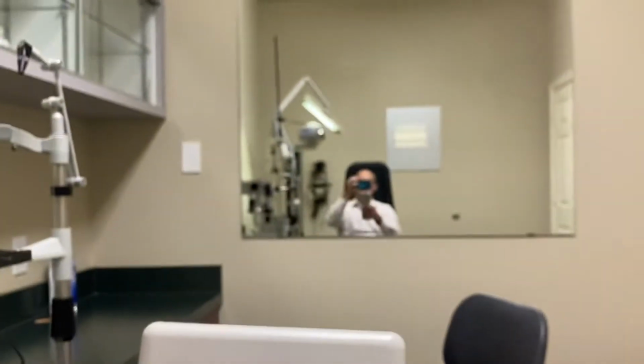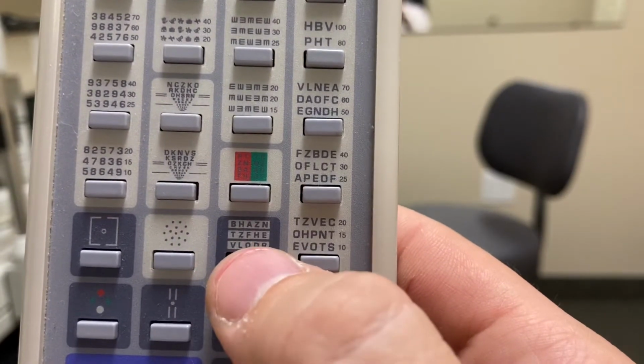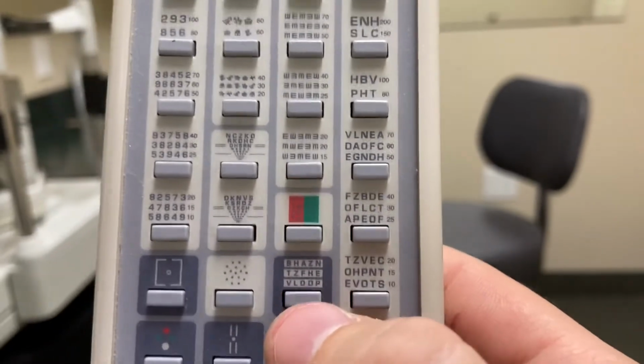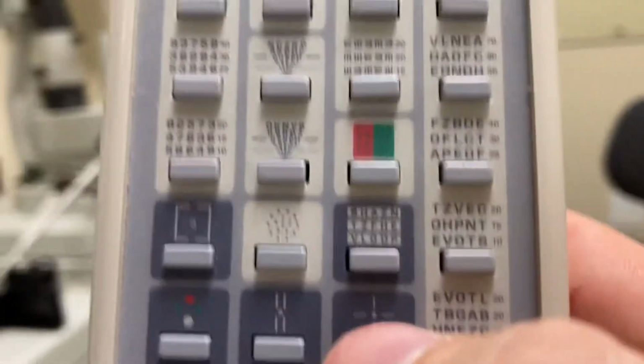This one is the polarized, where it's got one in the middle that both eyes can see, and then a polarized line of letters that it tells you on the key remote what it is for the top and bottom, which you can use in the Projector because it has a polarized.